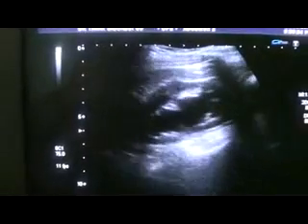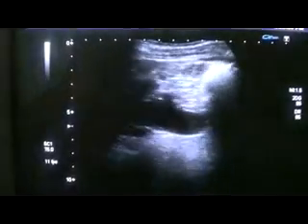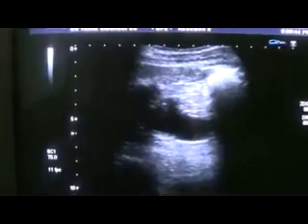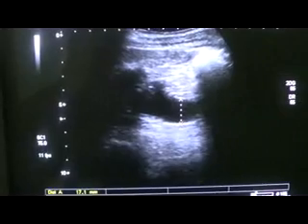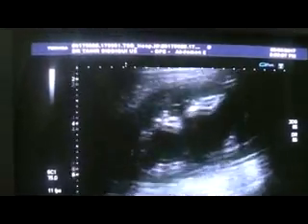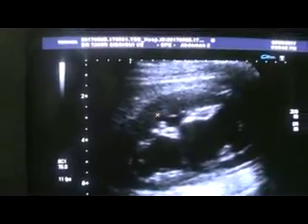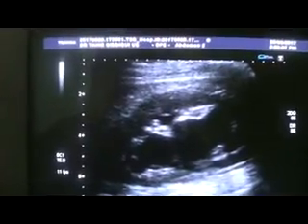and here you see this kidney is also showing minimal to moderate hydronephrosis with dilation of the proximal ureter. This is the proximal ureter, which measures approximately 16 millimeters, and we know that up to 7 is normal. So there is dilation of the calyces. All the calyces are dilated minimal to moderately. The echogenicity of the cortex is raised, medulla is seen. So the corticomedullary differentiation is intact, as is the thickness of the parenchyma.